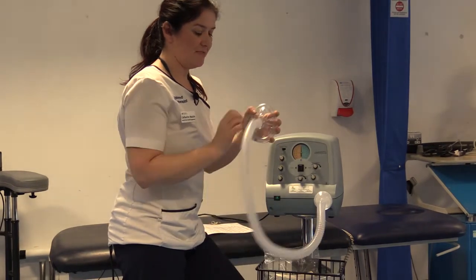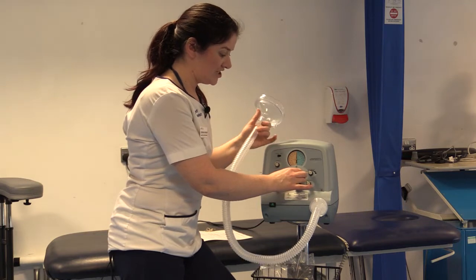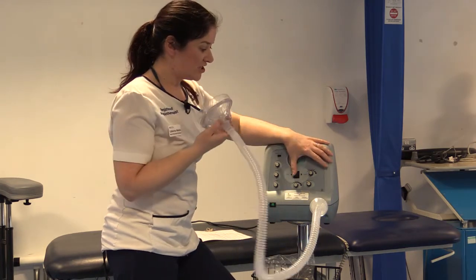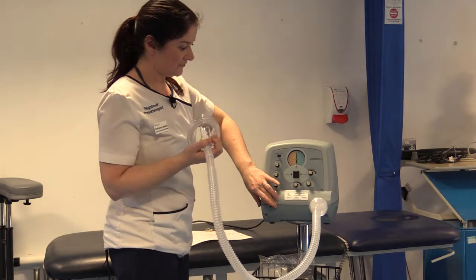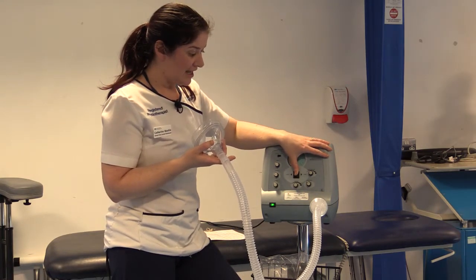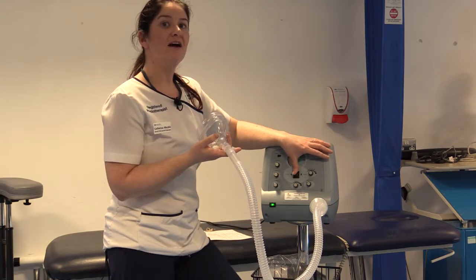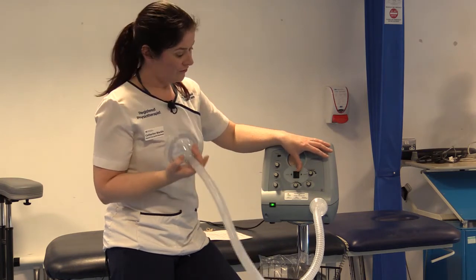Once you have your exhalation pressure set, check you have the inhalation pressure you need, then attach it to the face mask and apply it to the patient. With this machine you'll be manually flicking between inhalation and exhalation. If the patient isn't able to hold it on their face themselves, you may need a second person to assist. Ideally, start with inhalations and then move to exhalation. Your treatment is going to be determined by the patient.